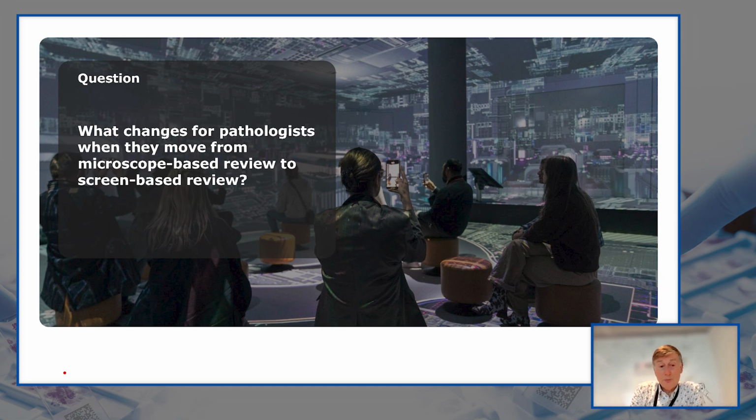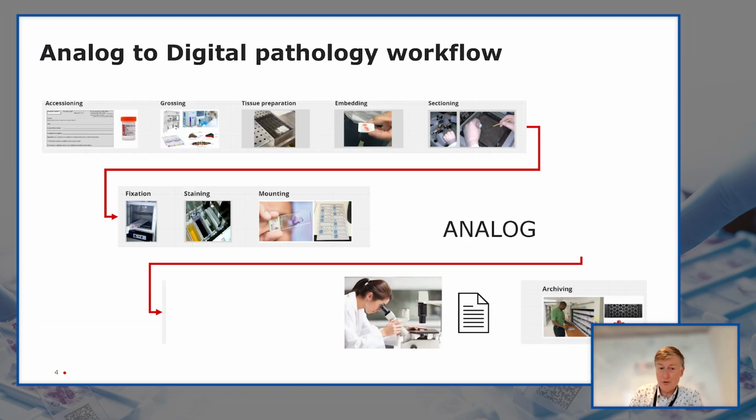Very good point, of course, and it's a whole transition to make, because pathologists are used to looking at a microscope. If you look at the current workflow, it's basically the whole wet lab. You receive the slides, it's a logistic process. Then you look at the slides under the microscope and generate a report. If that is already digital, we assume you probably use speech to text to create that report.